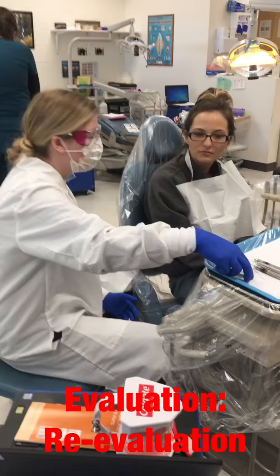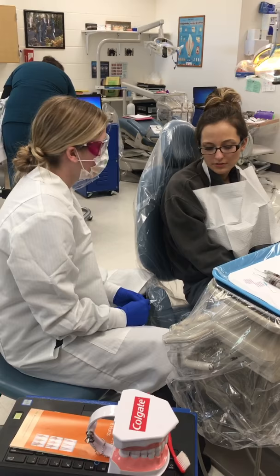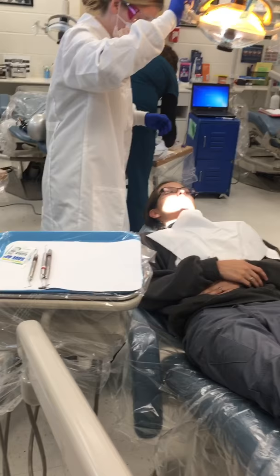So Lacy, how are the soft picks working for you — are you liking them? Yeah, I do like them, I just don't think they fit through all my teeth, they're too big to fit. We have some skinnier ones so I'll grab those for you. Now we're going to tilt your back and see how the treatment is working for you and see how the healing is coming along.